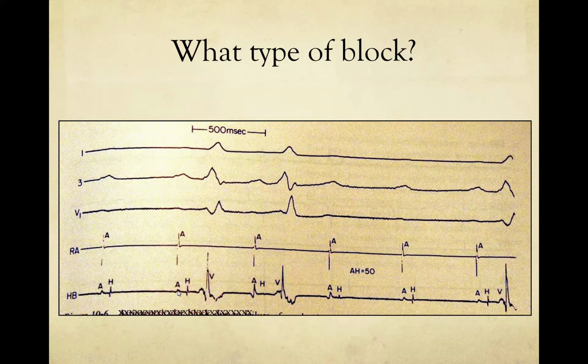So normally, when we say that somebody is Wenckebaching or Mobitz 1 block, what we're usually seeing is a conduction delay in the AV node. And remember that the AH is representing conduction in the AV node. Apologize for repeating myself, but I think that is helpful to learning.